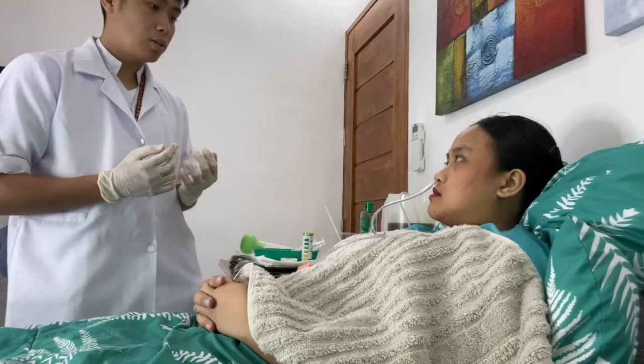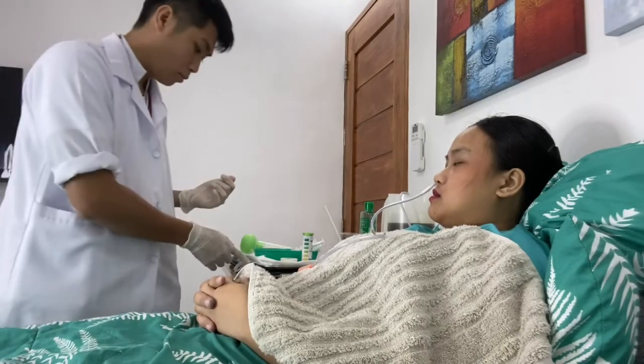Secure the tube by taping it to the bridge of the nose. Rationale: taping in this manner prevents the tube from pressing against and irritating the edge of the nostril. Ma'am, I'll just secure the tube, okay? Okay.